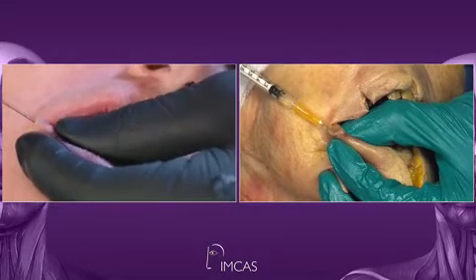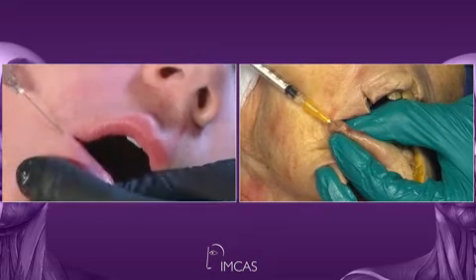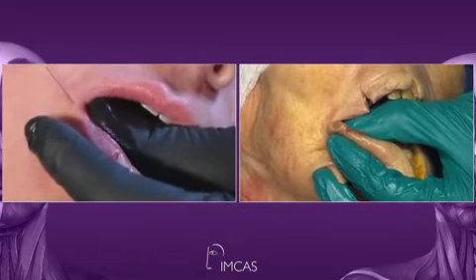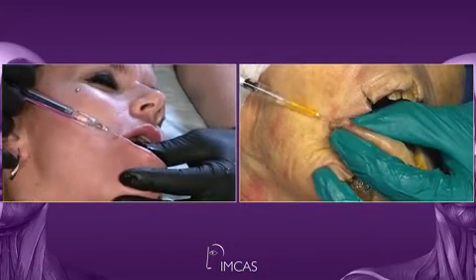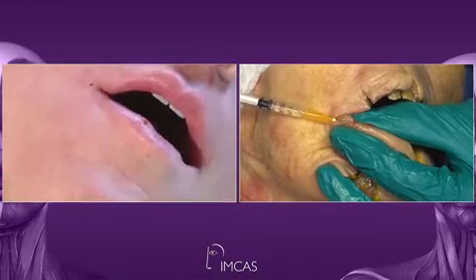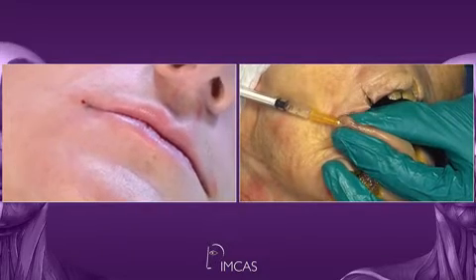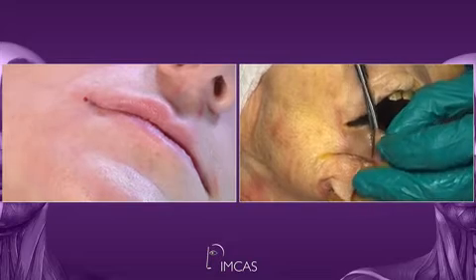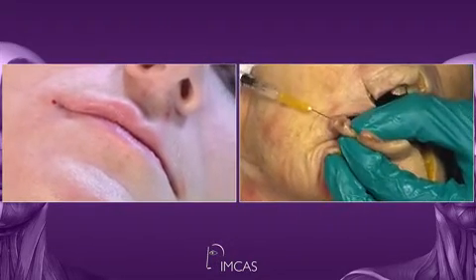Gently, just move. In the lower lip, there is basically no point in getting into the wet mucosa, because gravity will help us to create that eversion and volume change as we're looking for. But I will definitely put a little bit of volume just in the vermilion border, like that. Okay, so the cannula helps us to have smoother results. We still have not done any massaging with shaping or sculpting, and thanks to finding that correct layer, it's much easier for us.